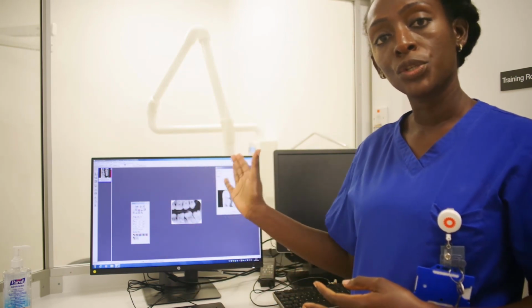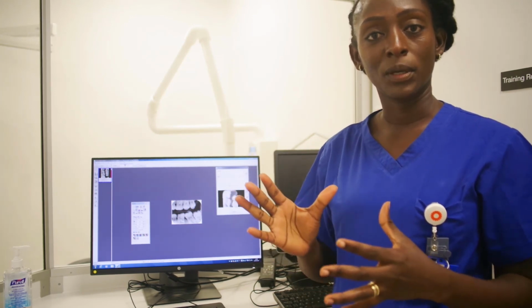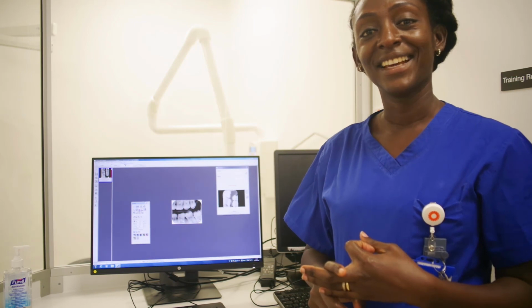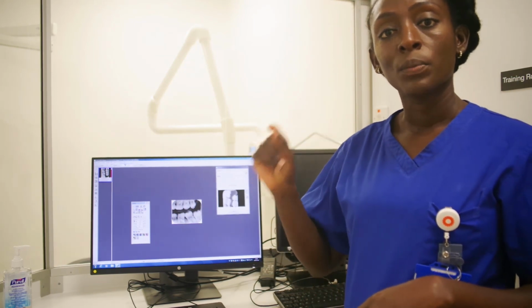So what grade do you think we can give to this? And this is where I want you to pause the video and think about it. Would you give it a 1, 2 or 3? Well done. So the answer is grade 2 and the error is positional error.